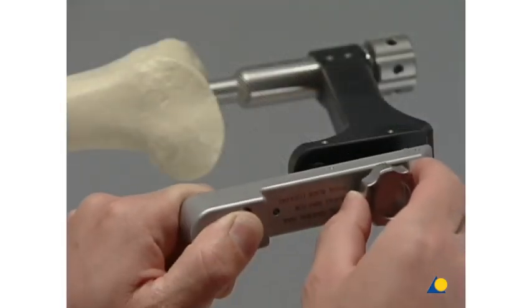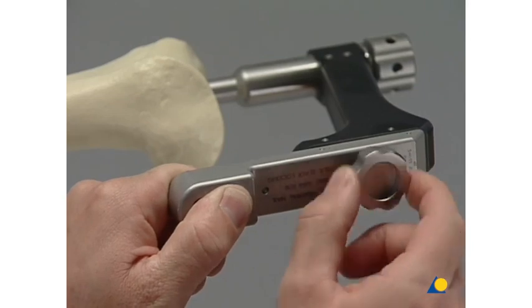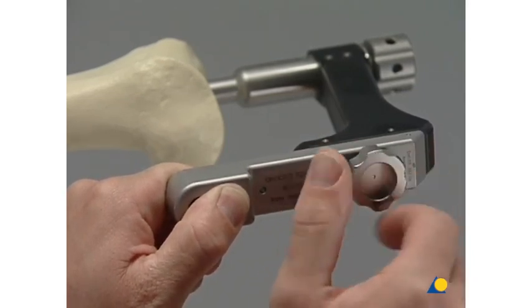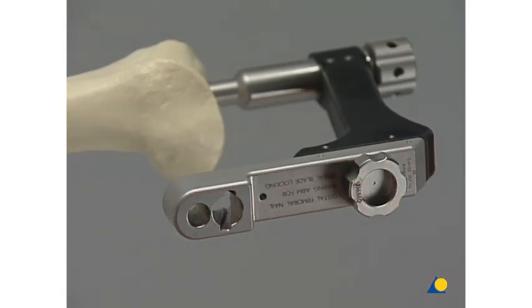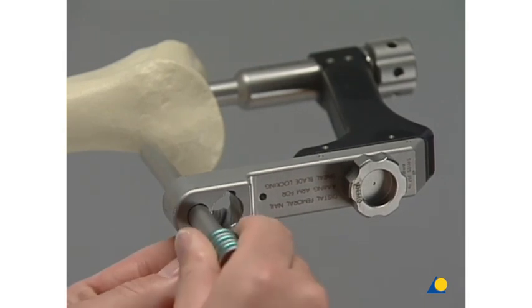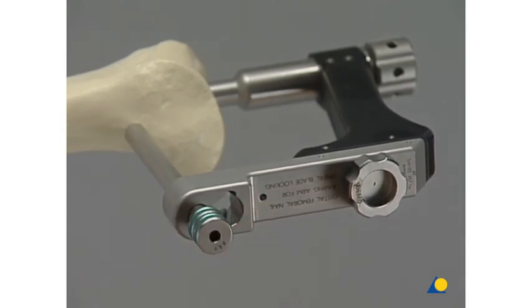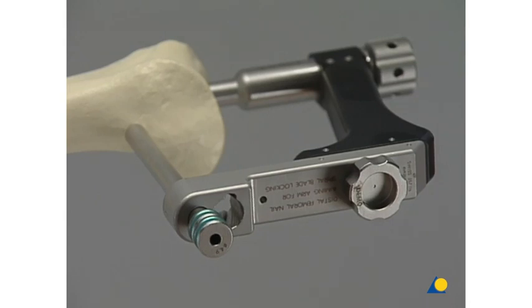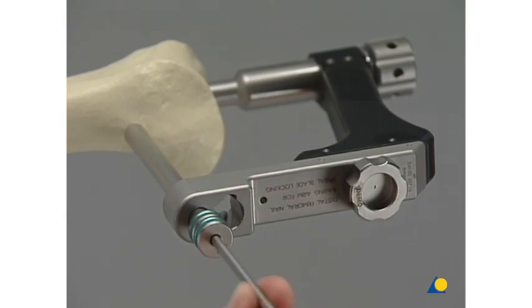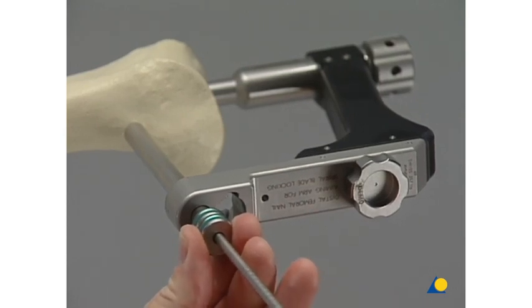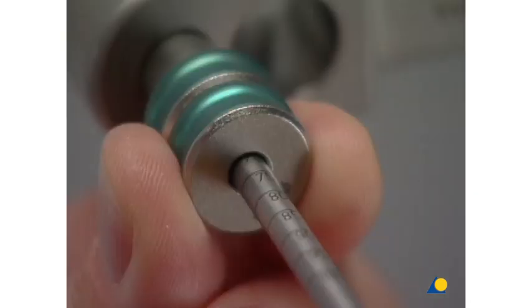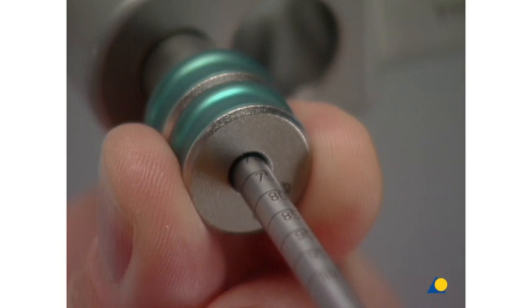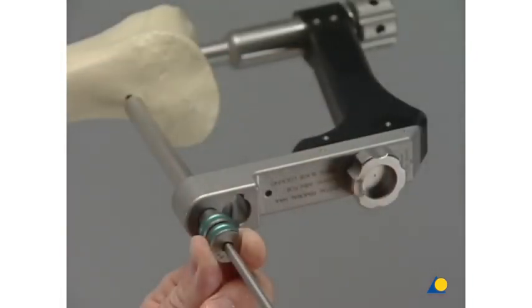Now the aiming arm is mounted onto the insertion handle. The trocar assembly is inserted through the cranial hole on the aiming arm and advanced through a stab incision down to the bone. Then the trocar is removed. The screw canal is drilled with the calibrated drill bit. The length of the required screw can be read from the ring marks on the drill bit. The reading will only be correct if the drill sleeve is touching the bone.